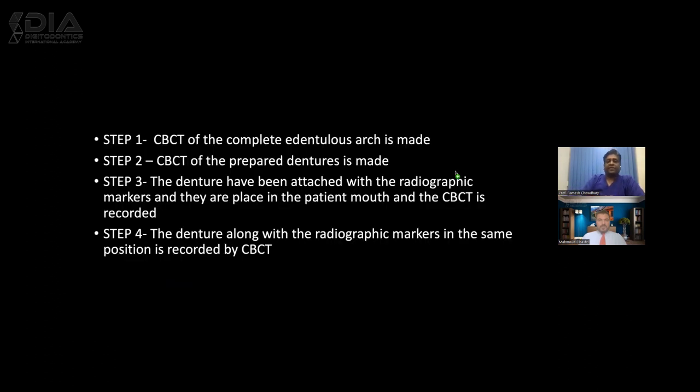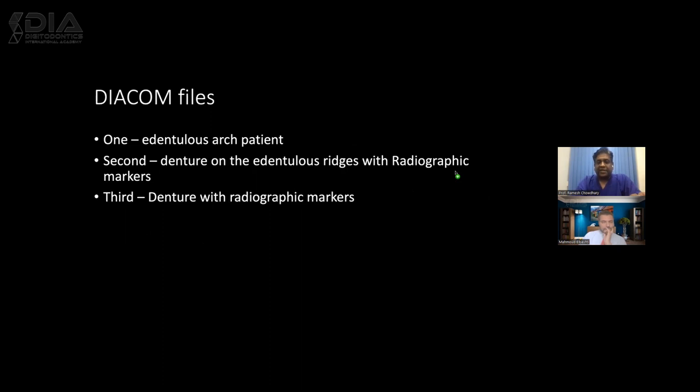If I have to tell you the stepwise procedure, first a CBCT of the patient's edentulous arches is made. This was the first procedure followed in those times when guided surgery initially started coming. So it was a CBCT of the patient, then a CBCT of the denture with markers applied, so that both the denture and the patient's CBCT were recorded together. This data was synchronized by applying the markers to the denture, so that these DICOM files can be transferred to the software. This is how the three scans using DICOM files are required.